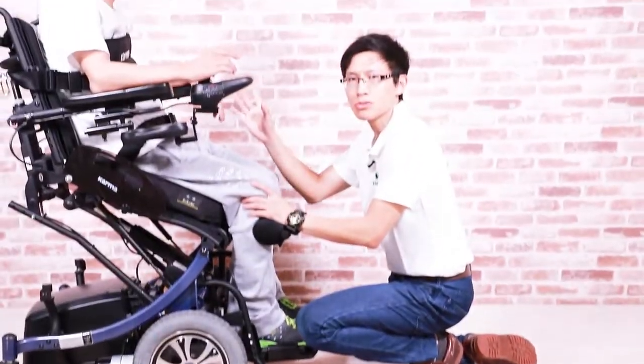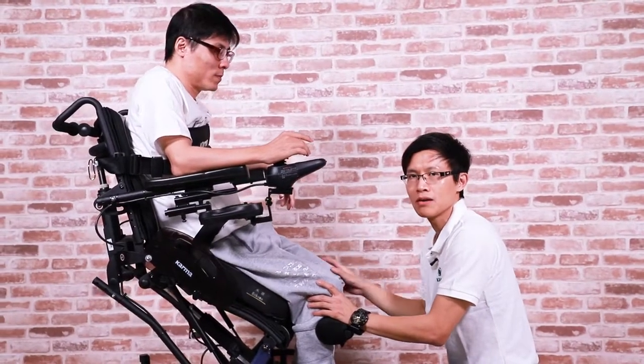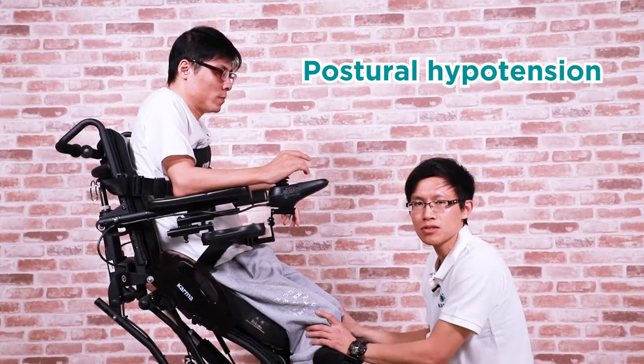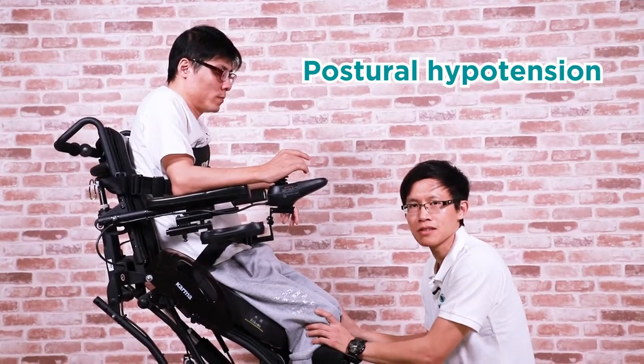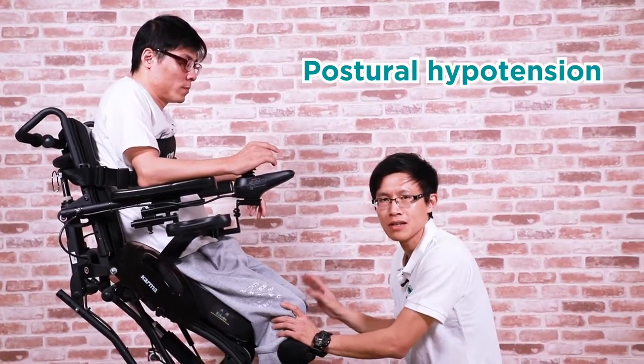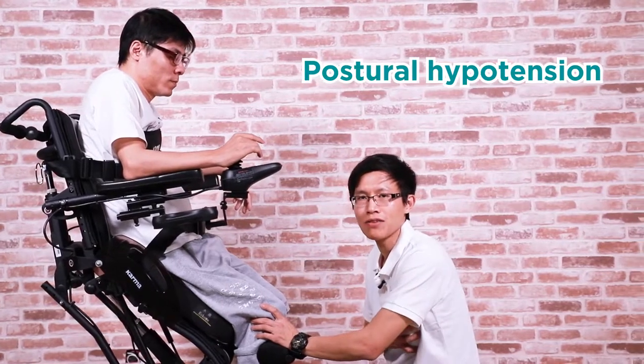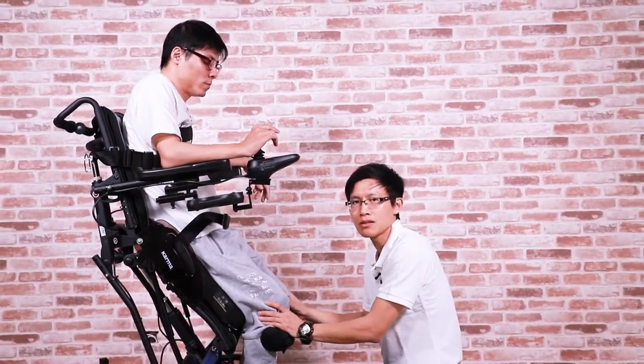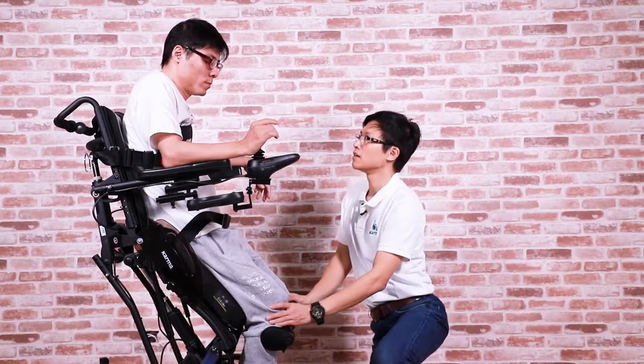Now, if the user turns pale or sweats all of a sudden during this process, this might be caused by postural hypotension. Postural hypotension occurs when a person's blood pressure falls when suddenly standing up from a lying or sitting position, because the heart is unable to circulate enough blood to the head. The user might feel dizzy. Should this happen, we can pause, change the position back to sitting, and then rest a little bit.